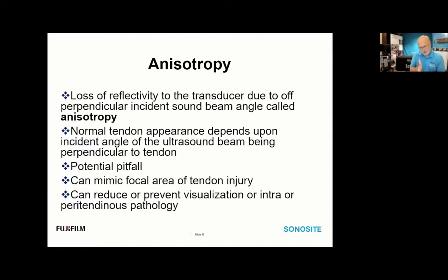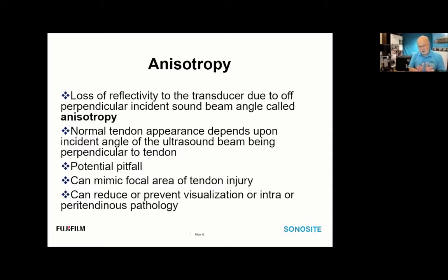If you're 90 degrees to the anatomical part with your transducer, the sound beam reflects directly back and echoes are displayed. Anisotropy can be a pitfall because it can mimic a focal area of tendon injury, or reduce visualization of intra- or peritendinous pathology — particularly fluid defects. If echoes reflect away from the transducer, you get zones of echo dropout, making it difficult to recognize dark fluid against a dark tendon.